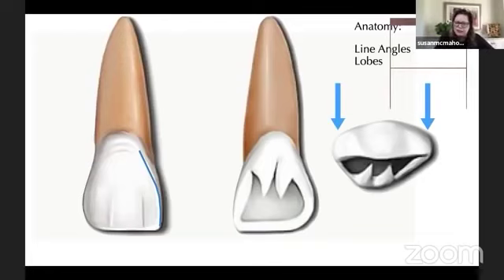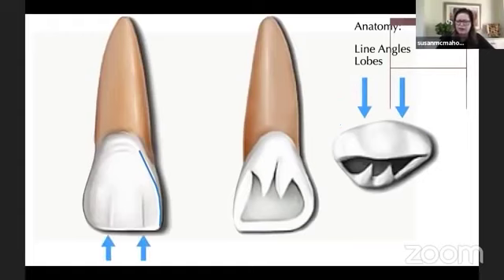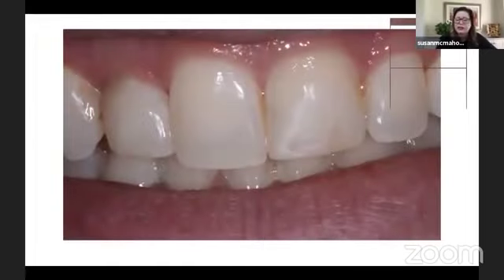And the second thing we sort of lose when we're doing anterior composites are the lobes. And every anterior tooth has facial lobes. Some are more pronounced than others, and it just depends on the anatomy of the teeth. So we're going to look at how to make those line angles right and how to finish those lobes and get them to look the way they're supposed to. And to do it in 10 minutes.